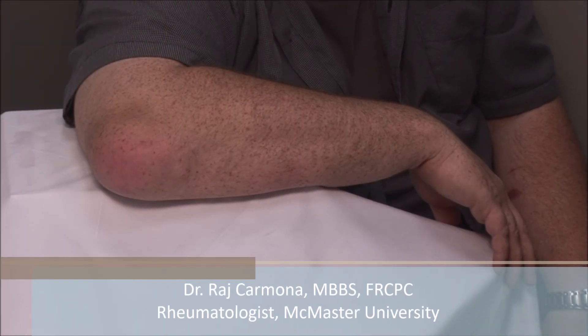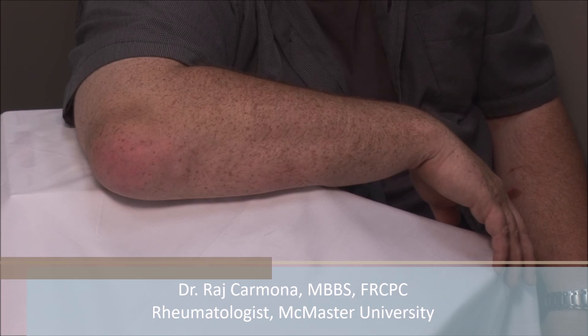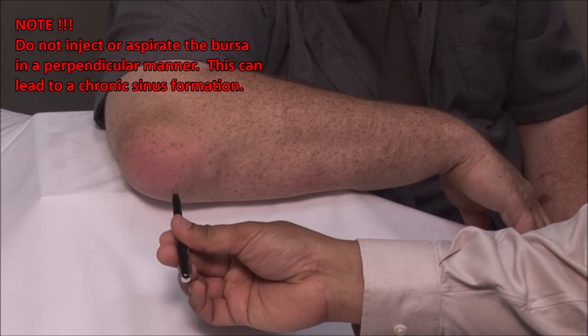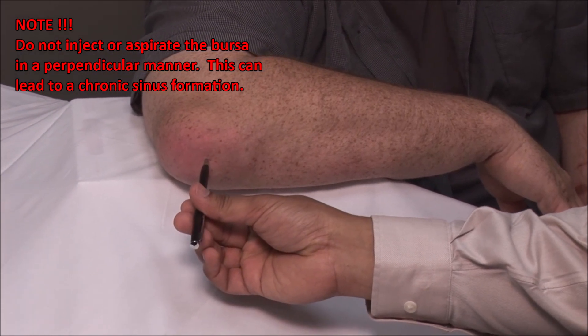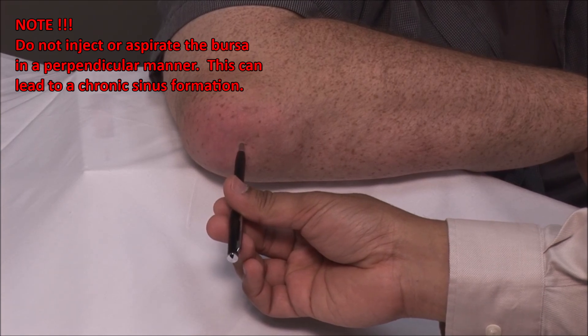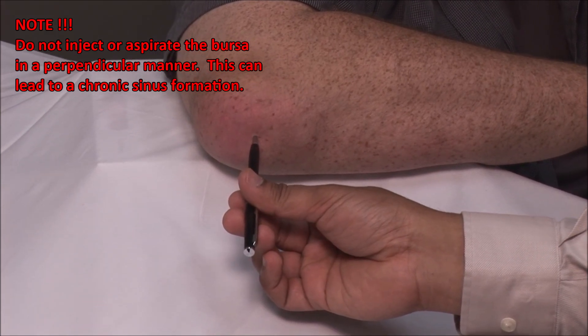This patient has gout with an inflamed olecranon bursa containing tophi and free fluid. Injection of the bursa should never be done in a perpendicular fashion. This can lead to recurrent drainage each time the patient flexes the elbow, and can also act as an entry point for infection.